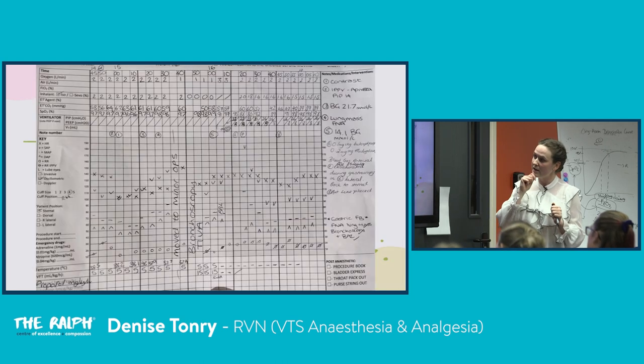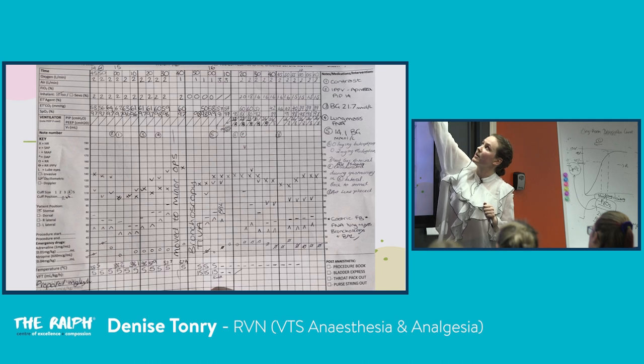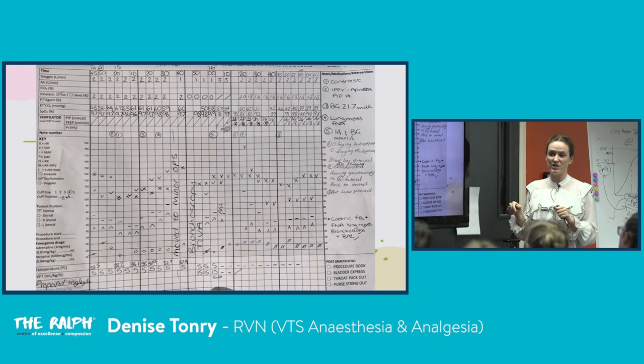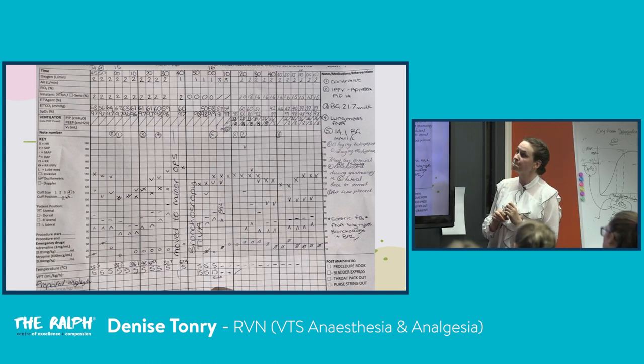This was, let's say, a 30 kilo Rhodesian Ridgeback cross breed, and she was having a CT, a bronchoscopy and a BAL. I bring her to CT, in sternal, and I'm providing IPPV here, providing apnea, and recording my PIP. I'm using quite a high PIP of 14, because this patient has lung pathology. When I inflate her lungs, her chest is not moving that much, so I'm providing a slightly higher PIP to try and achieve that.